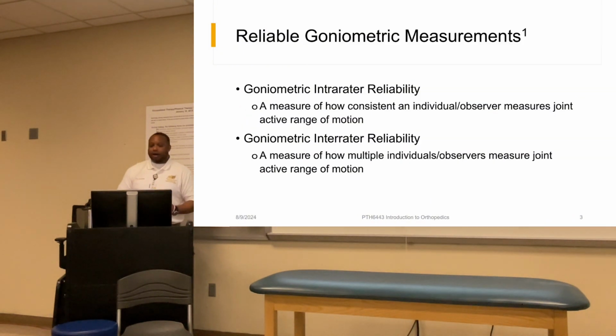So we're going to talk about reliable goniometric measurements. What makes goniometric measurement reliable? And what are the different types of reliability?